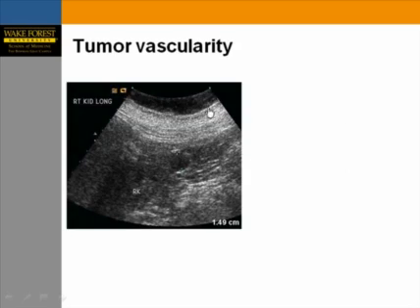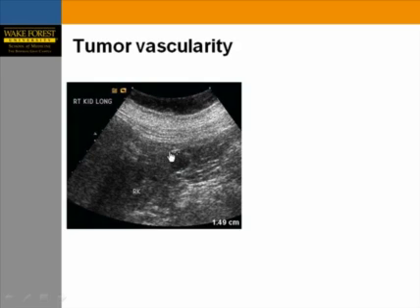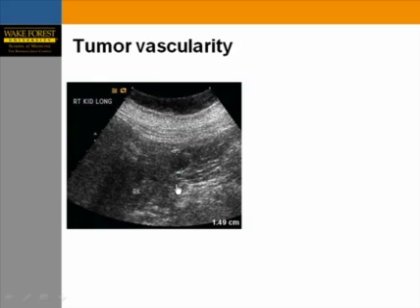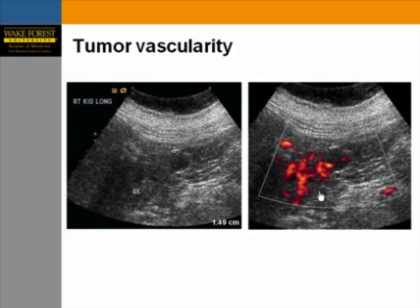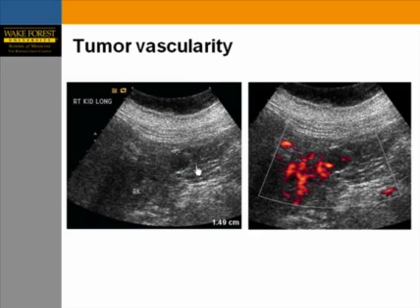In a large patient referred for renal ultrasound, a hypoechoic mass was incidentally identified in the lower pole of the right kidney without much acoustic enhancement. Power Doppler identified areas of increased vascularity, and this was subsequently proven to be renal cell carcinoma.